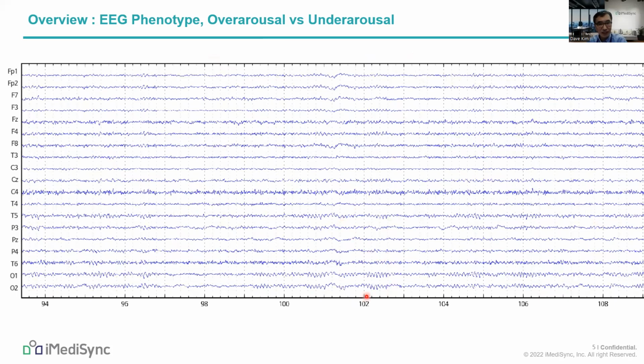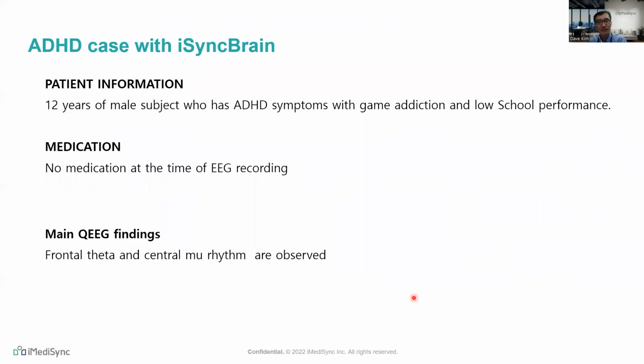In this case, you can see there is a lot of alpha, with very small alpha amplitude, but a lot of oscillation. Usually, this is a 1 second period. Usually 10 hertz is normal, but in this case, there are many oscillations here. The alpha frequency is very fast, and we can see a lot of small beta activity. This is the over-arousal. Basically, we have described the under-arousal and over-arousal.